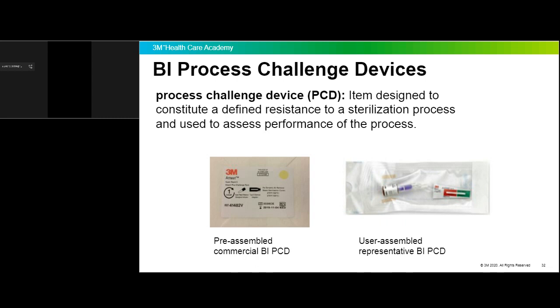There are user-assembled process challenge devices, and those are typically used for tabletop sterilizers. We'll talk about that more in detail later on. And then there are pre-assembled, commercially available PCDs, having the advantage, of course, of being made in a factory, a very consistent, standardized challenge. These are typically used in the large sterilizers found in hospitals and surgery centers.